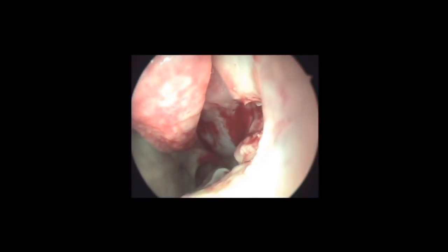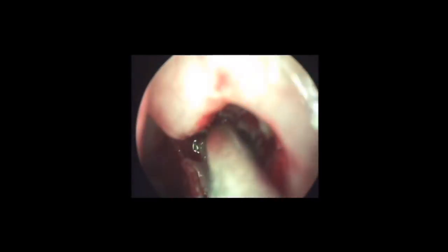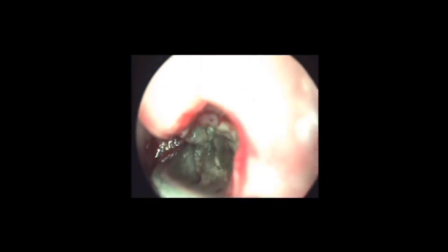In this video, you could see the maxillary sinus is filled with fungal debris. Using a ring curette, the fungal debris is being mobilized and removed without injuring the healthy mucosa.